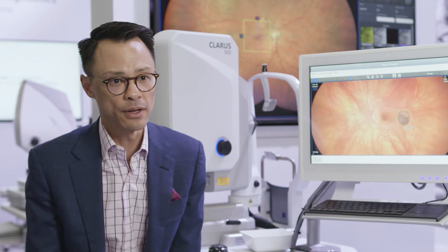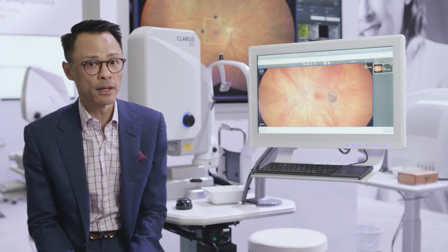It's difficult to imagine practicing without the CLARUS 500. I feel very confident in what we're able to produce with the CLARUS 500 in quality of care as well as in the efficiency of care.